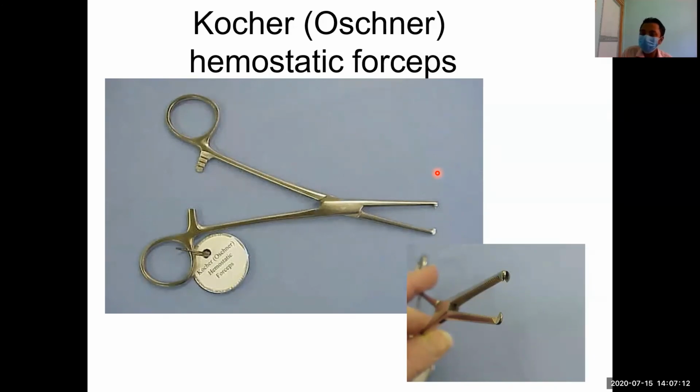But before wrapping up, we do not need to confuse sterilization and disinfection. Generally, most of the surgical instruments we will autoclave, metal instruments as well as rubber instruments. Sharp instruments we will keep in Lysol, and laparoscopic instruments like fiber optic cystoscopes and laparoscopes, which have a glass assembly inside, we will leave in 2% Cidex or 2% glutaraldehyde solution. So that's all, those three means for most of the surgical instruments.